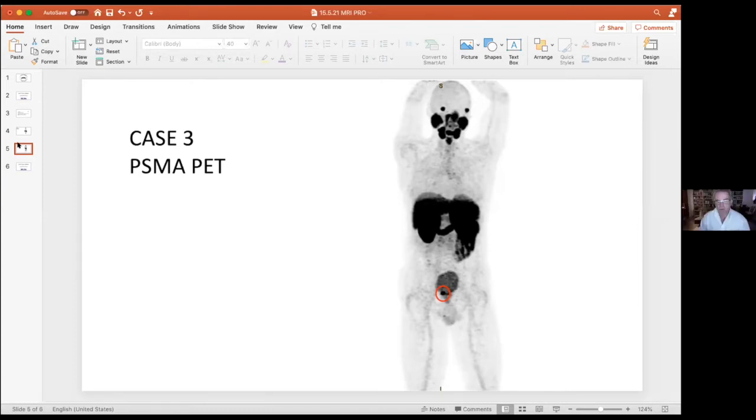We do both. So in fact, all three. So local and sedation on the NHS. I think you get a good feel about whether the patient's going to tolerate it under local when you speak to them, and then obviously general. If you've got the right setup and good anesthesiology, it can work very, very quickly. Patients love it because they don't feel anything. I think it makes the whole thing a little bit easier. We haven't proven that, but if millimeters matter, having the patient completely relaxed so that you can do targeting in the way that you want to, you'd think would make a difference.